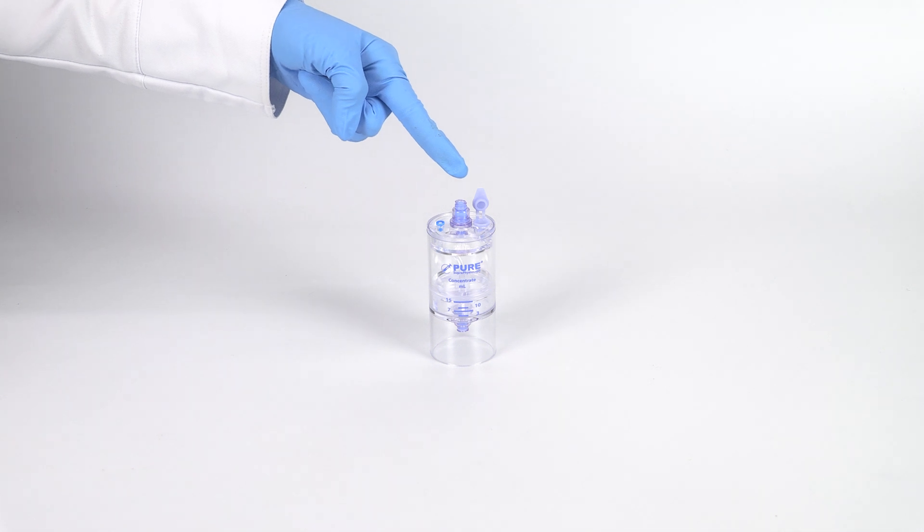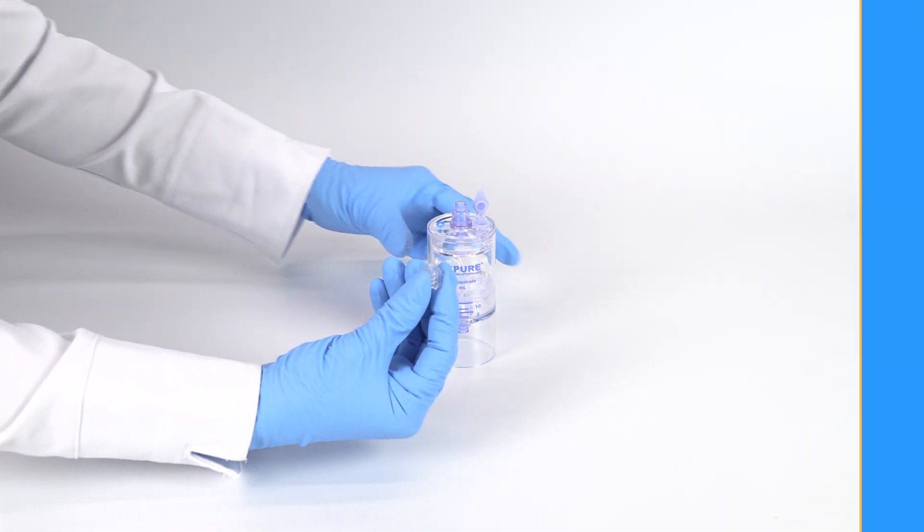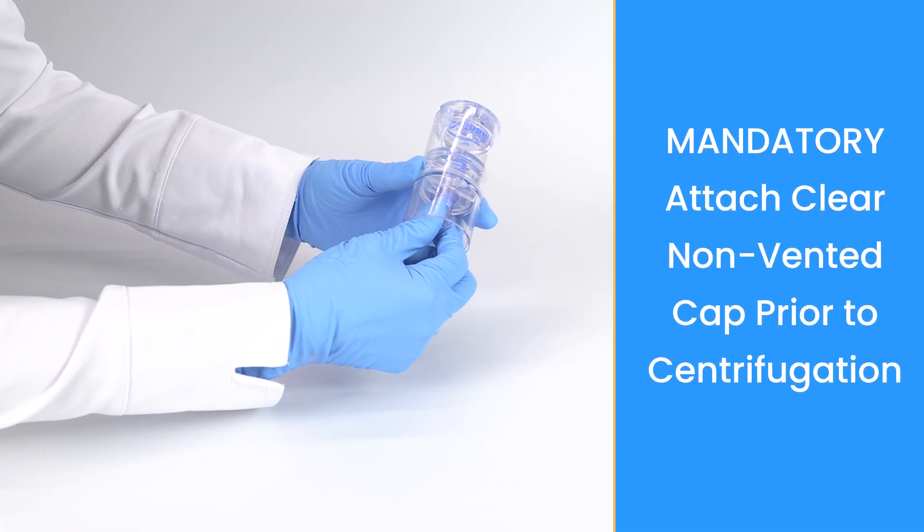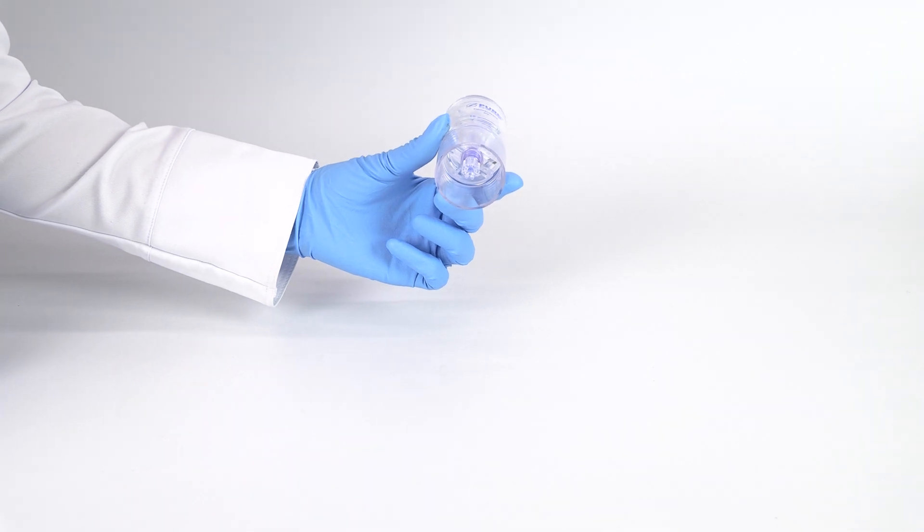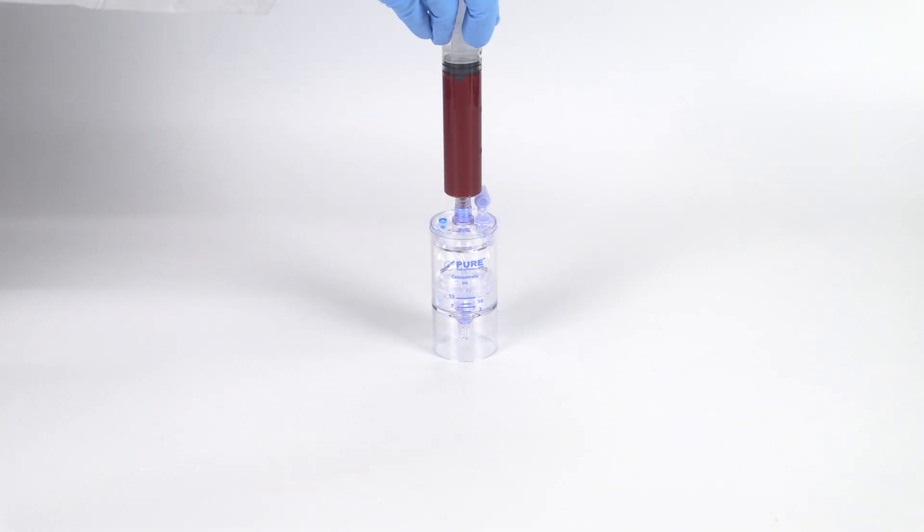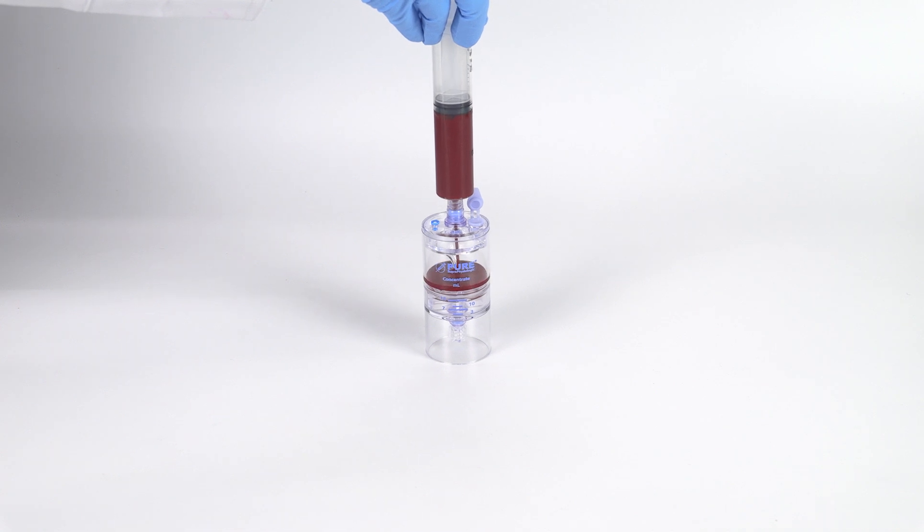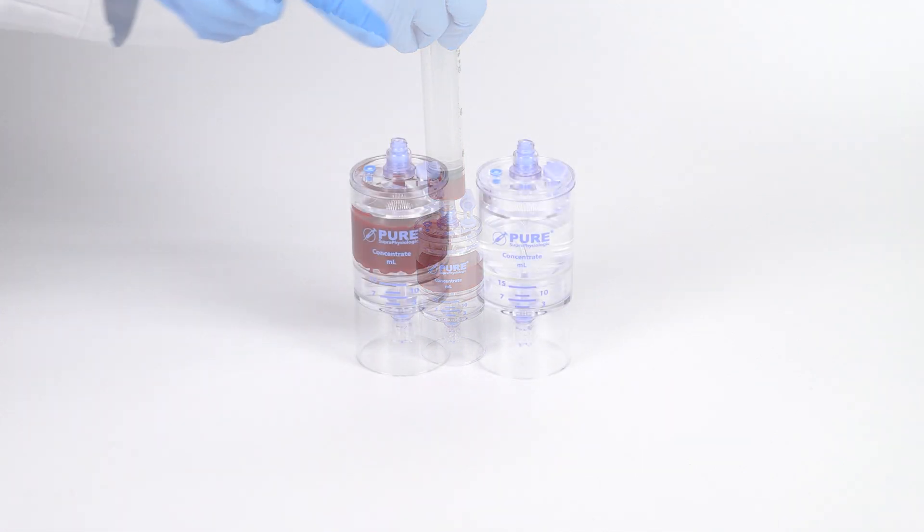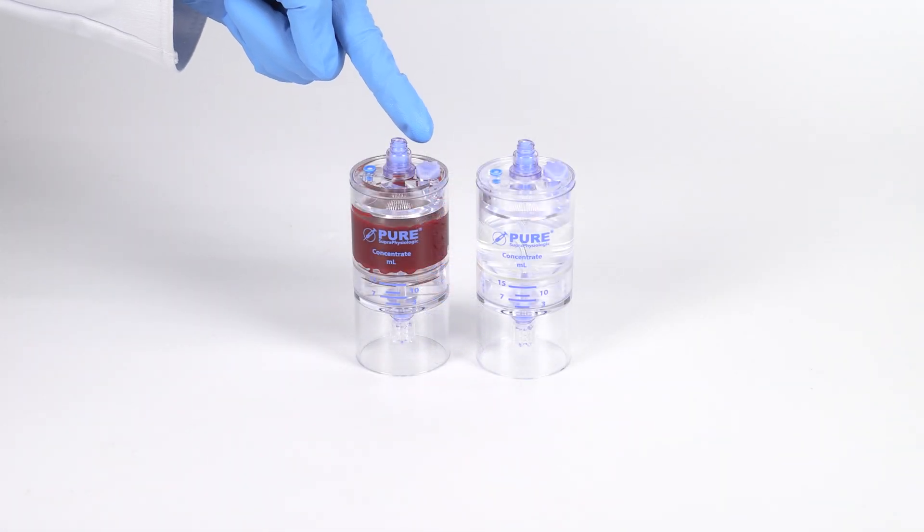Make sure the vent lid is in the open position. As a mandatory step, always attach the clear non-vented cap to the bottom port prior to centrifugation. Attach the 30-milliliter bone marrow syringe to the needleless port and slowly inject into the separator device. When completed, close the vent.